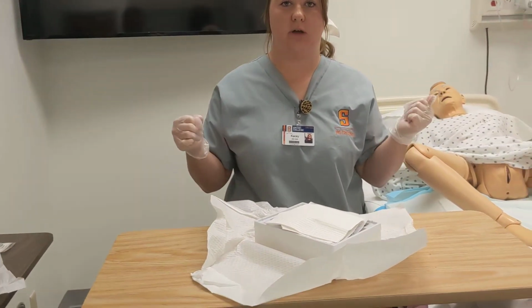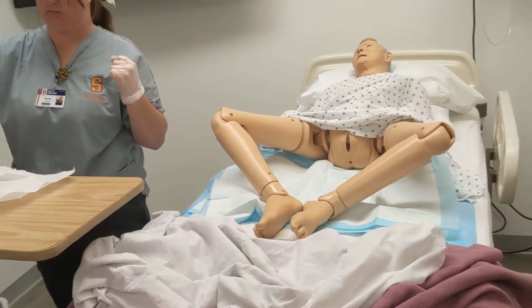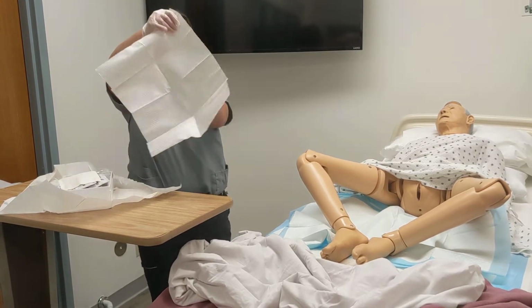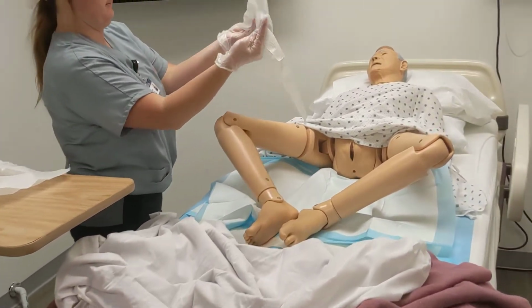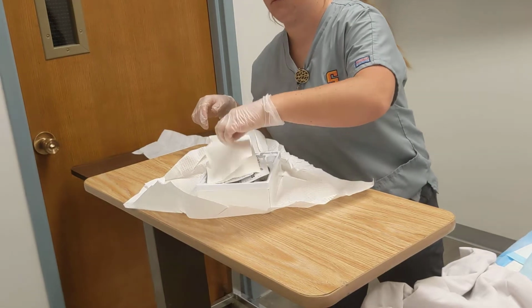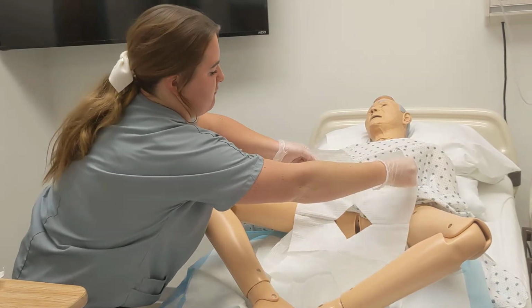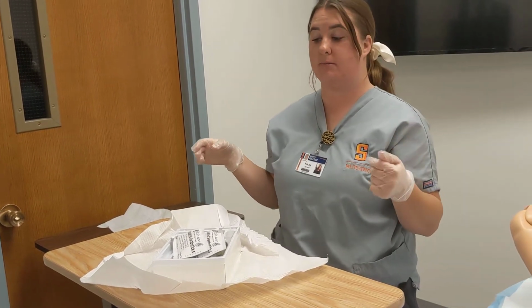So now we are going to put our drapes on the patient. Okay, so now we are going to open up all of our supplies next.